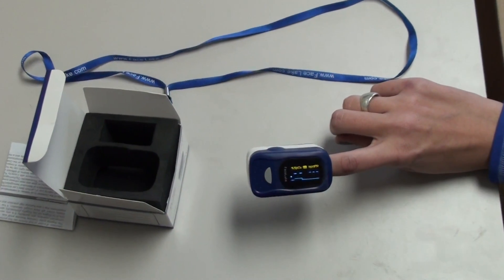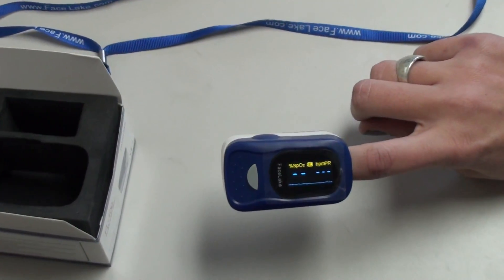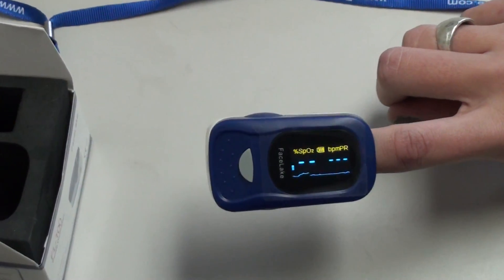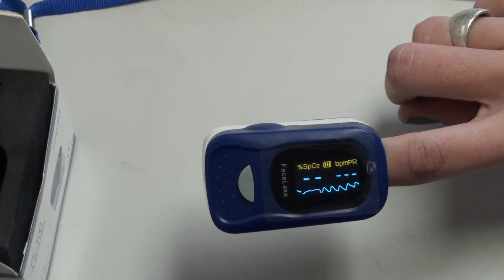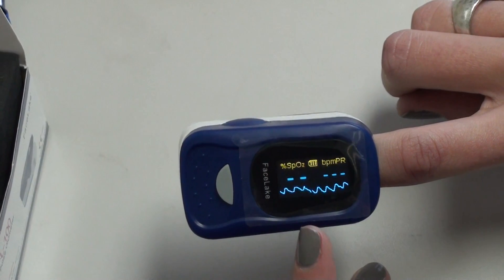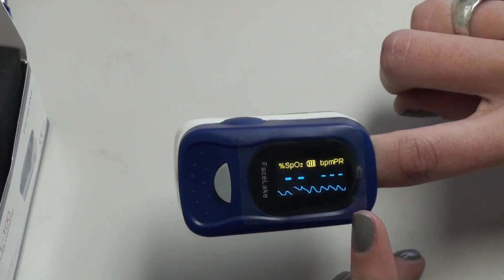Once we wait for a reading, I'm going to show you everything that this product has to offer. On the left hand side you're going to see the SpO2 levels, and on the right hand side the number will represent the pulse rate.